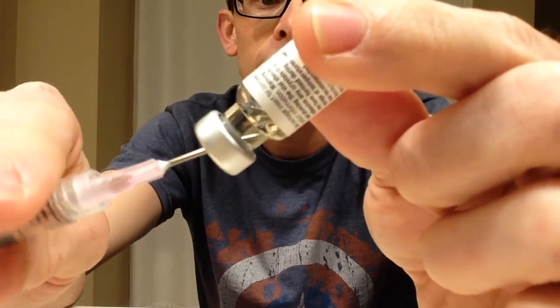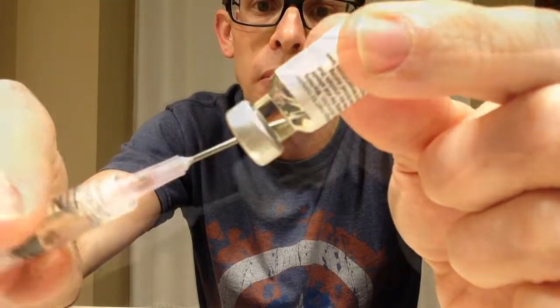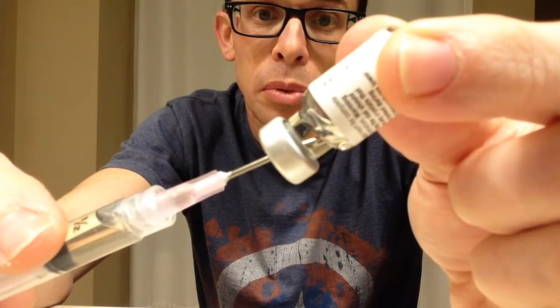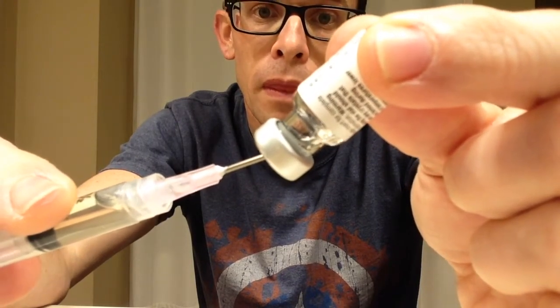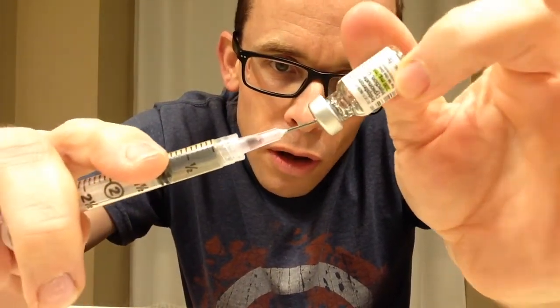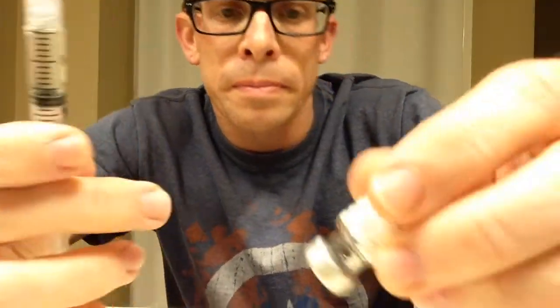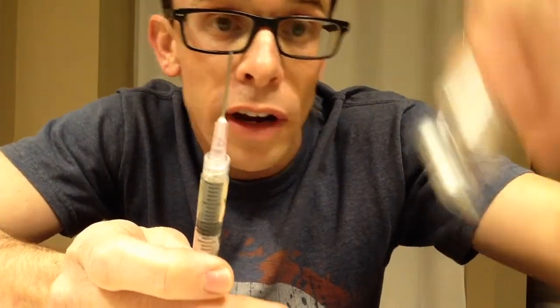See the needle inside there? I can kind of wiggle it around. I like to get the needle close to the very bottom because I want every drop out of this that I can. And so I'm just slowly pulling all this out. And then try to get every little last bit of this out. I want all the testosterone, homie. Okay, I feel good with that. Now I've got basically all of it out, so I'm happy with that.